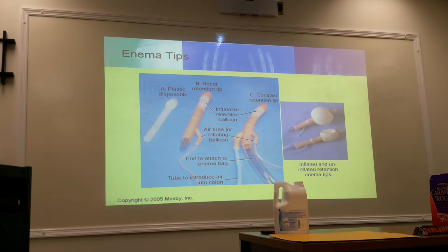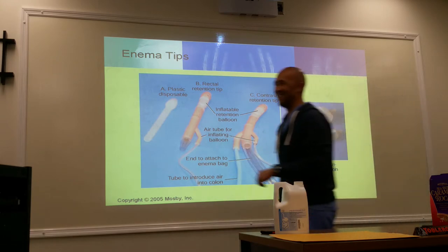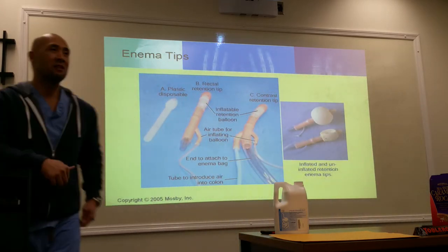So how do you know whether or not? Well, when you puff up the balloon, okay? So after insertion and you puff up the balloon, what you're going to do is give it a couple of tugs. They're going to be like, what are you doing back there, Sonny? To make sure it's nice and secure. And if it just comes right out, now we're going to give it another inflation. And they probably won't feel it.